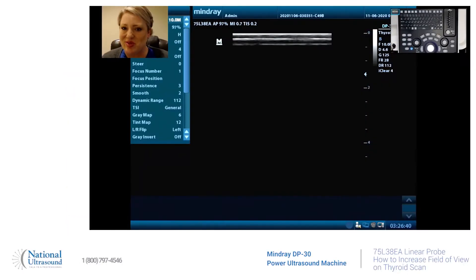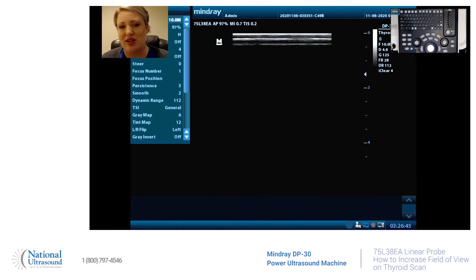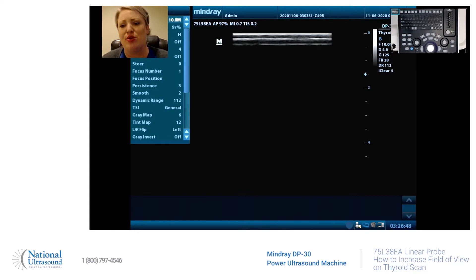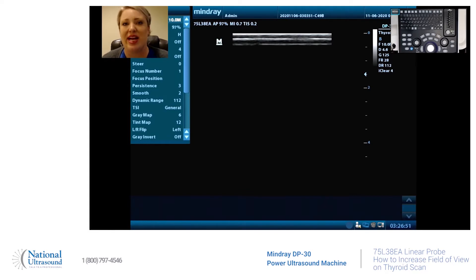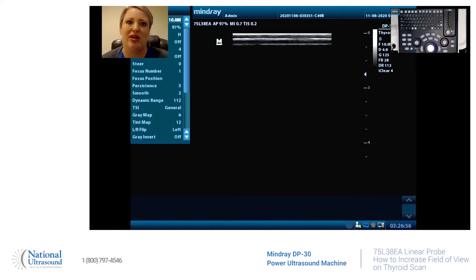Hey you ultrasound gurus, this is Holly. I am a registered cardiovascular and general sonographer. Today at National Ultrasound I am on the Mindray DP30 and I am using the linear 8 probe.